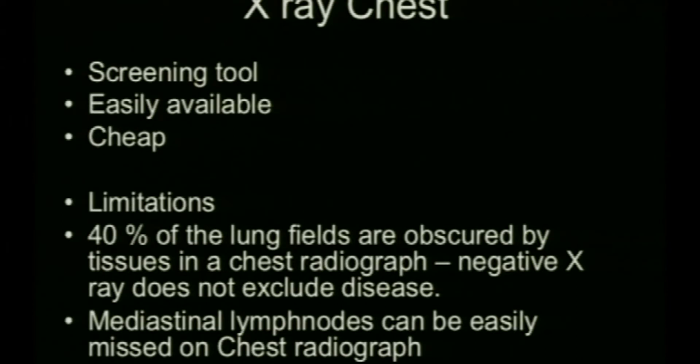So coming to the simplest investigation, that is the X-ray chest, which was widely used at Shankar Nethralaya once upon a time, but slowly there is a shift from X-ray chest to HRCT. Now, why do we have this shift? Basically, it's a good screening tool. It's easily available at all outpatient departments, and it's very cheap.